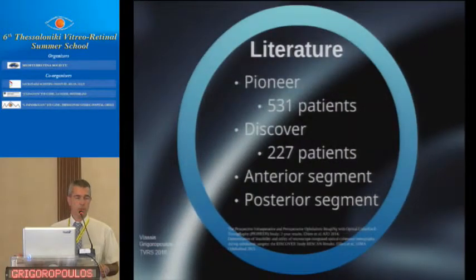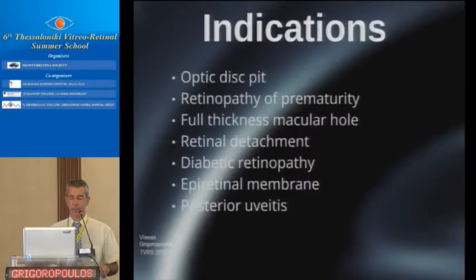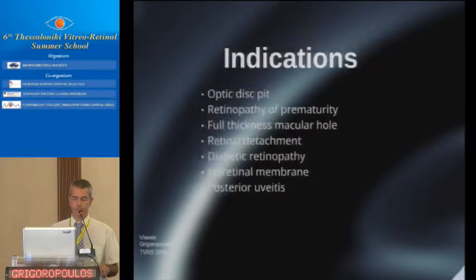But as posterior segment surgeons, we're interested in the posterior segment, and those are the cases in which the intraoperative OCT was used so far: for optic disc pit, for retinopathy of prematurity, macular holes or epiretinal membranes, for retinal detachments, diabetic retinopathy, and also some cases of posterior uveitis.